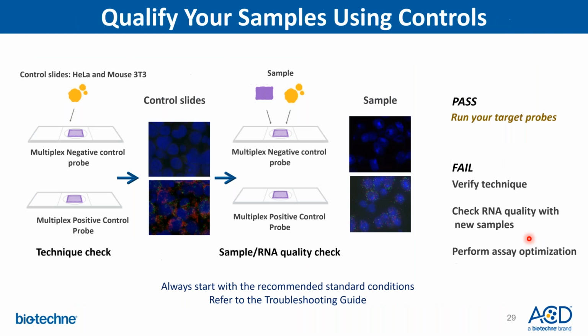We'll next look at how you qualify your samples using the controls, and this is an ideal workflow that we would recommend. To start with, we would recommend that you perform a technique check using control cell pellets such as HeLa or Mouse 3T3 that are available from ACD. So you run the multiplex negative and positive control probes on those, and you want to see really good staining for all the 3-channel probes or 4-channel probes for the positive control, and clean imaging for the negative control probe.